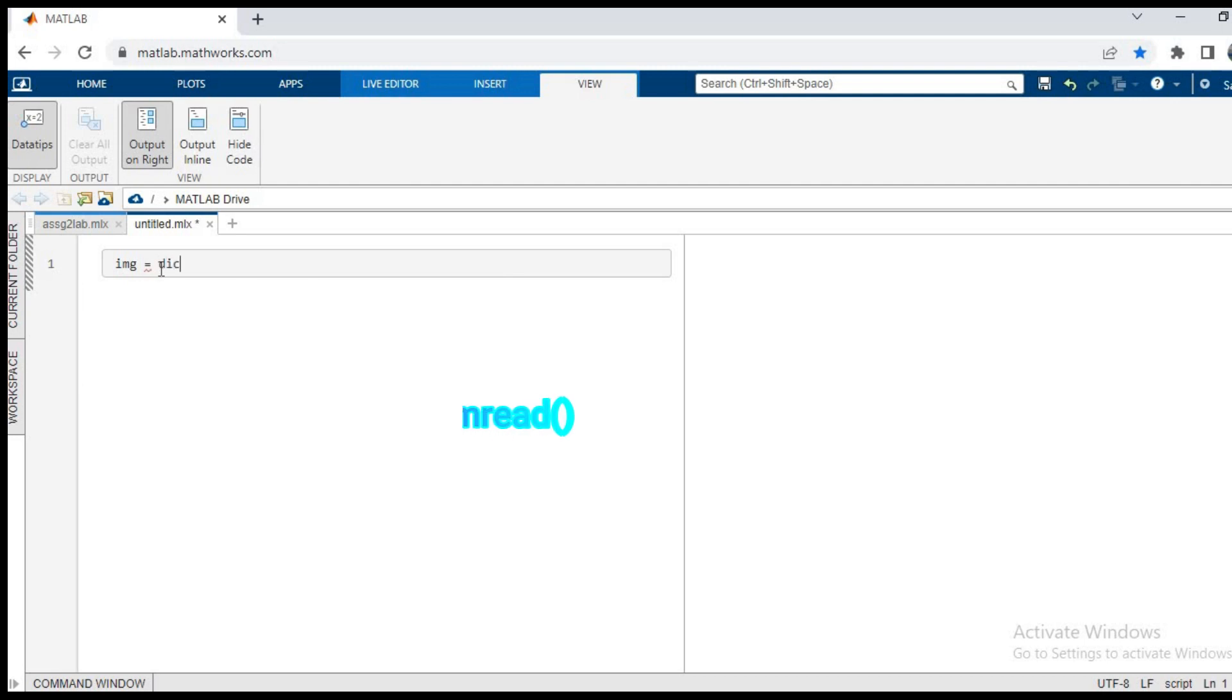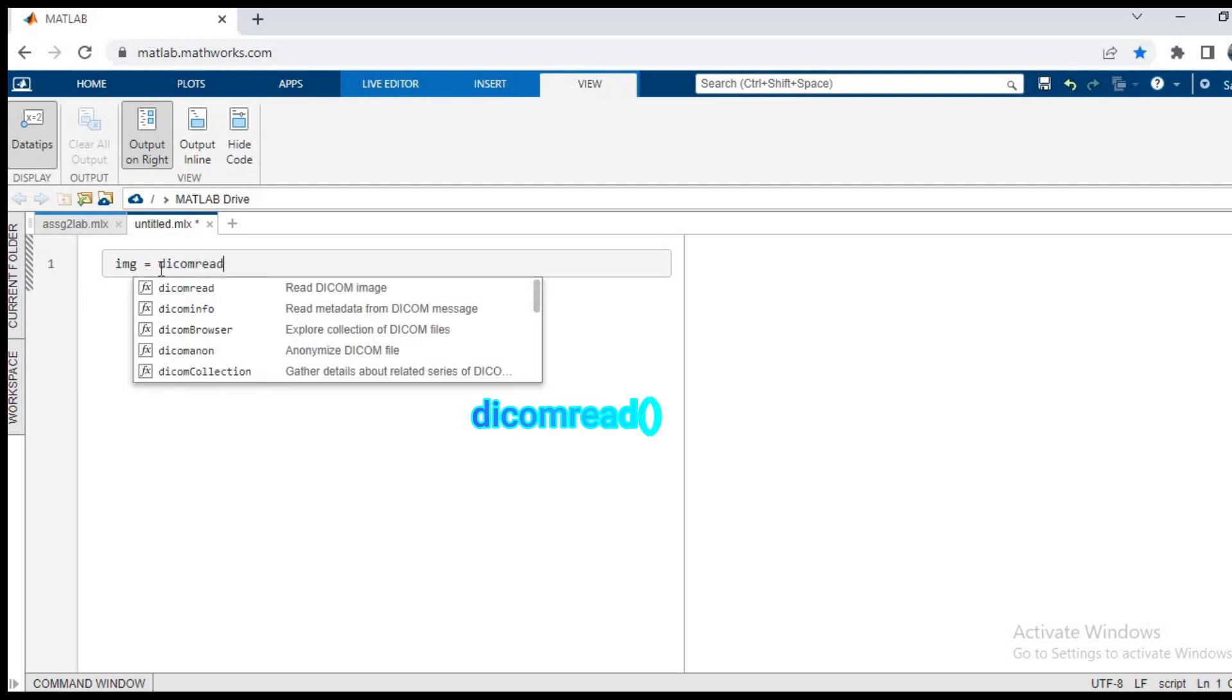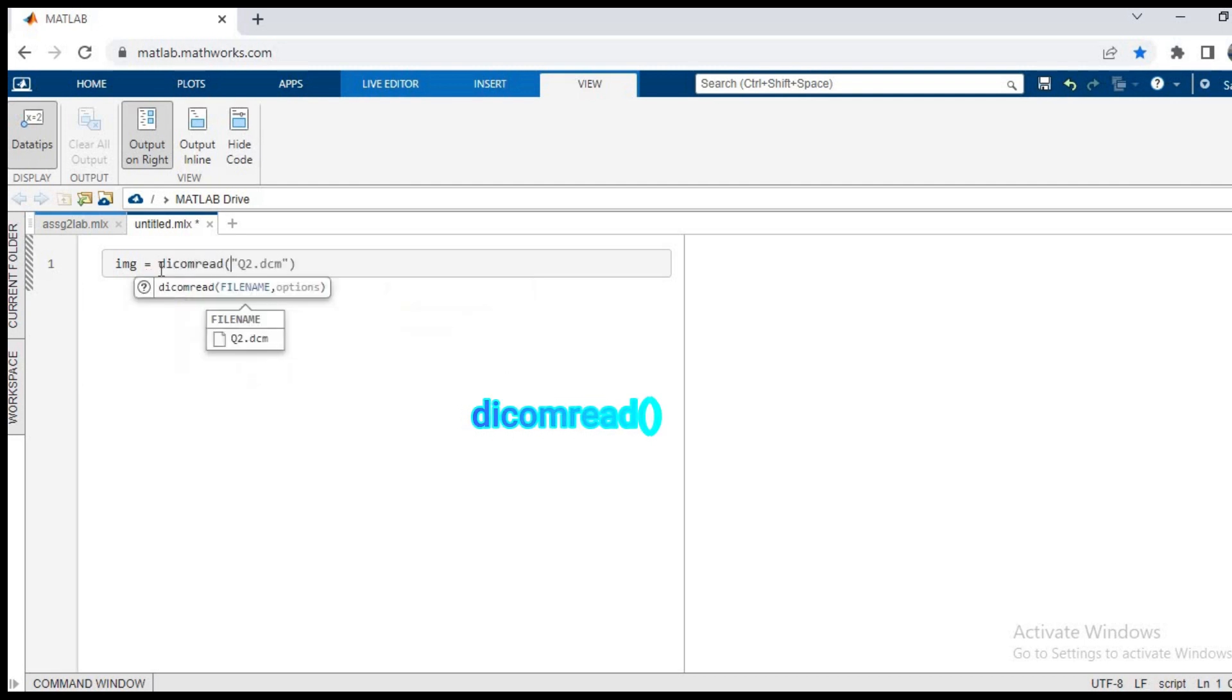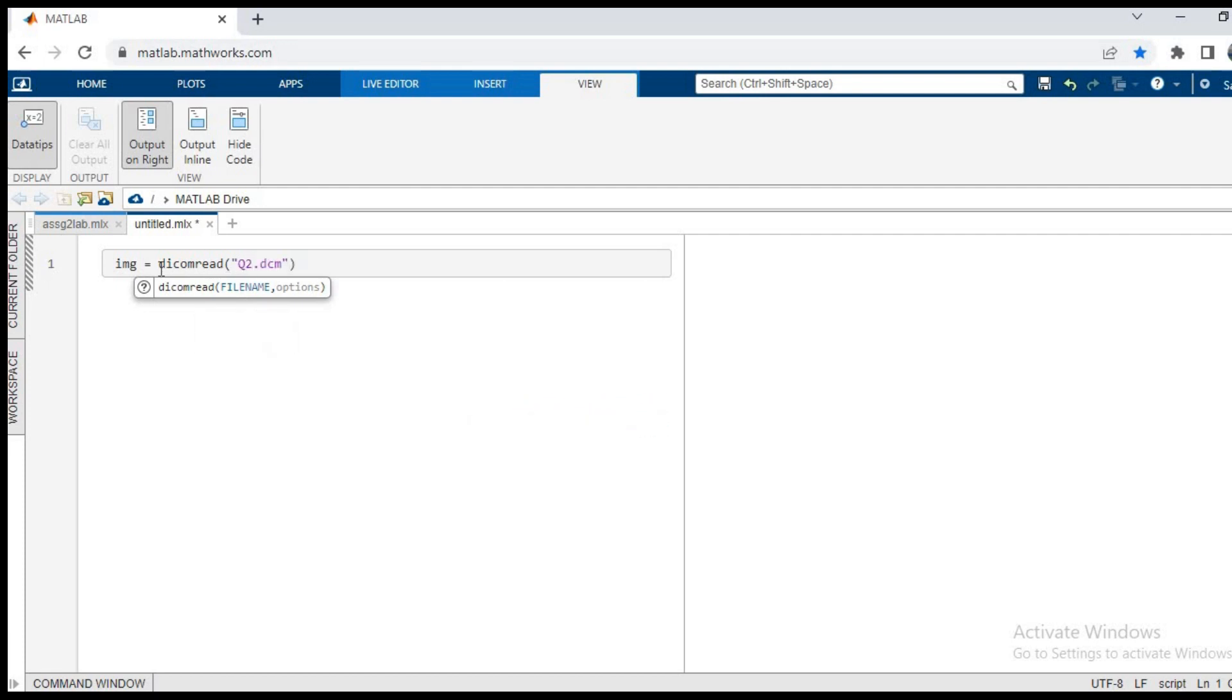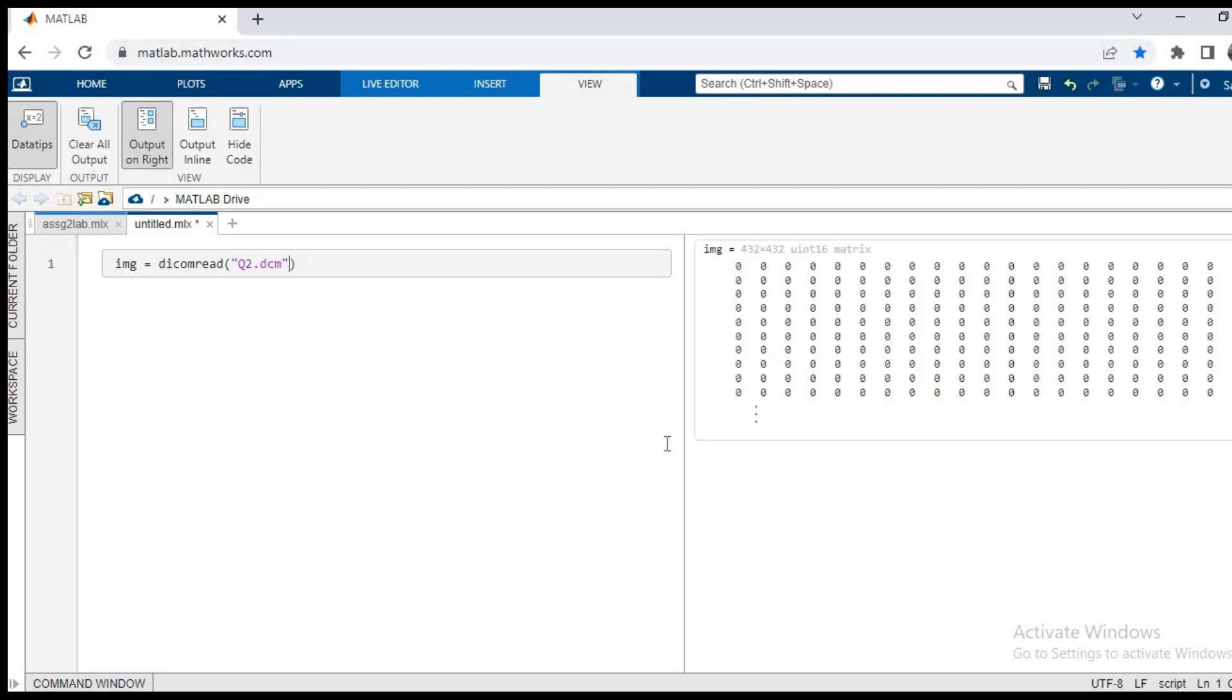We'll name the matrix as img, so img is equal to dicom read q2.dcm. As we can see, the matrix has been created from the file.